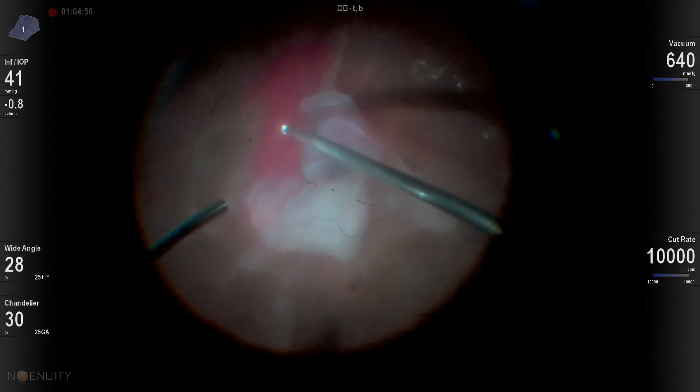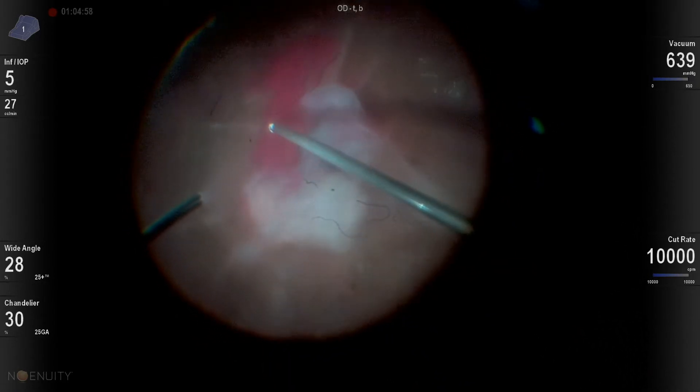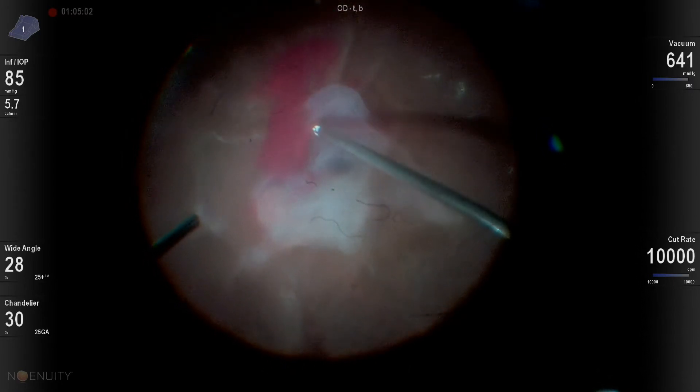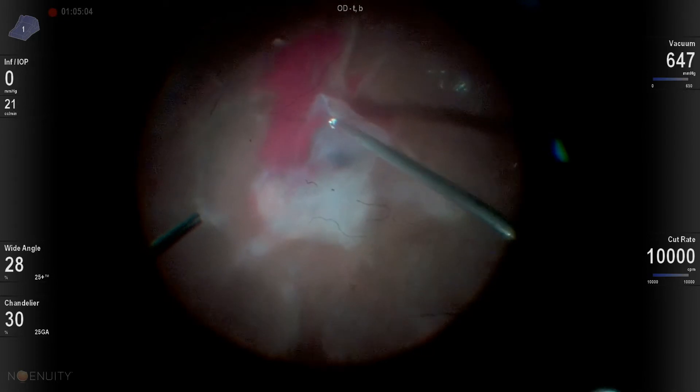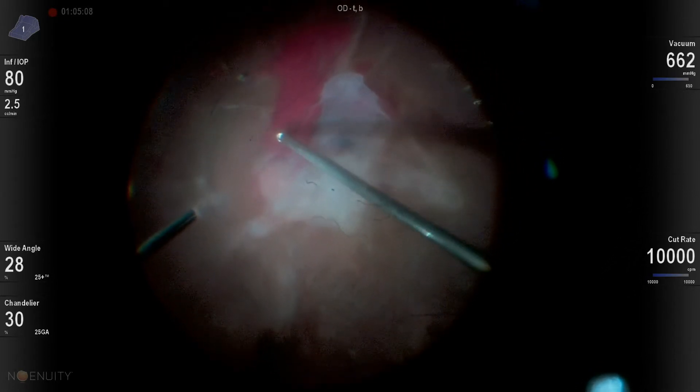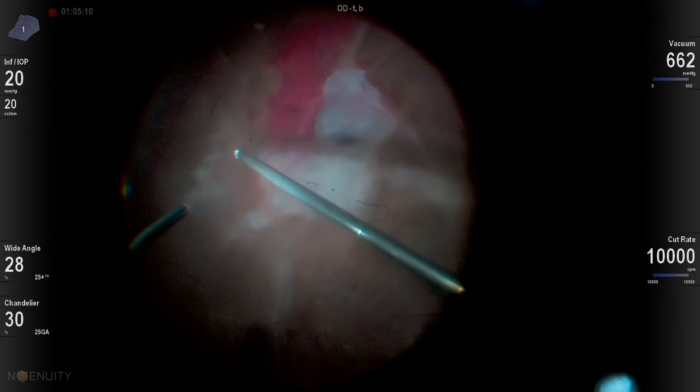I just try to go for the easiest locations I possibly can to start my segmentation, and I mostly segment. Chandelier light is really critical in these cases if you're going to do any bimanual surgery. I thought this one might need bimanual surgery, and in fact it didn't need bimanual surgery.